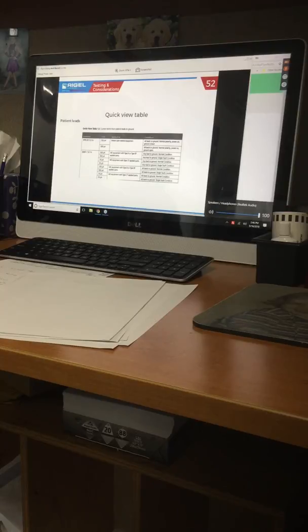Back early in the presentation, we talked about CF, type B and such. When you look at the classifications for cardiac floating, it was 10 microamps per lead, 50 microamps single fault condition. And we're saying at NFPA 99, 100, 500 microamps. But when you think, okay, 10 leads times 10 microamps gives you 100, 10 leads times your 50 gives you your 500 microamps. So in effect, we are kind of testing at the same conditions for the same values.